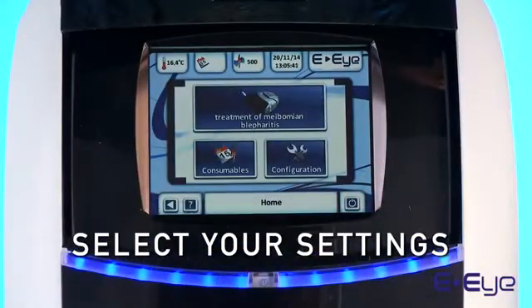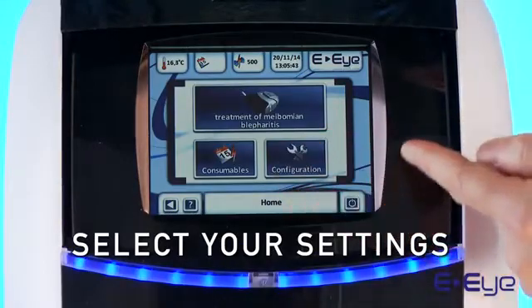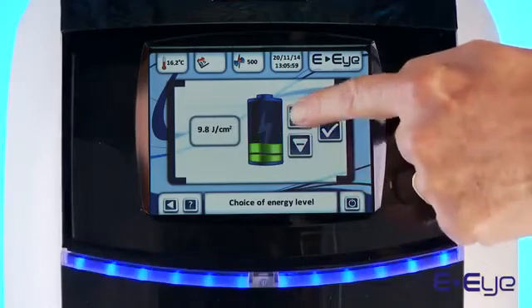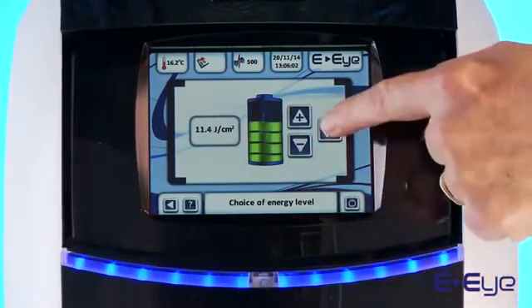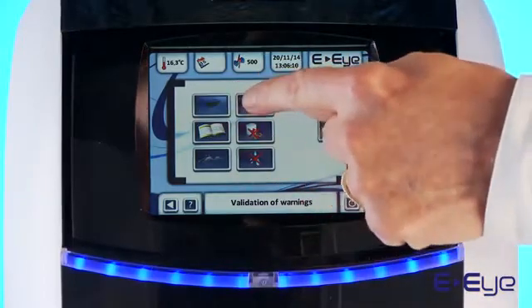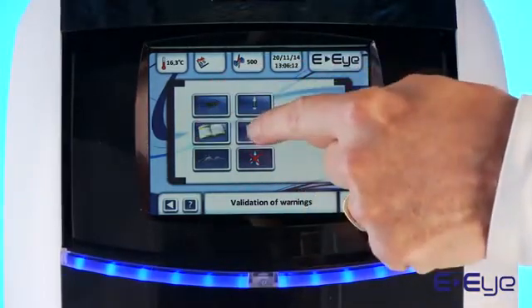Now select your settings. Select the Meibomian blepharitis treatment menu. Adjust the desired intensity level of the issued flash. Validate each safety feature by pressing one by one on each safety icon.